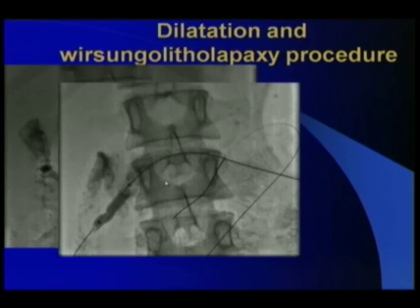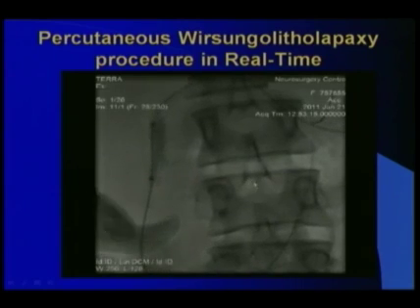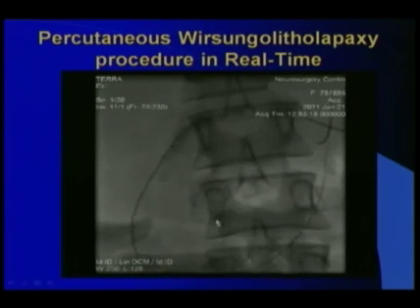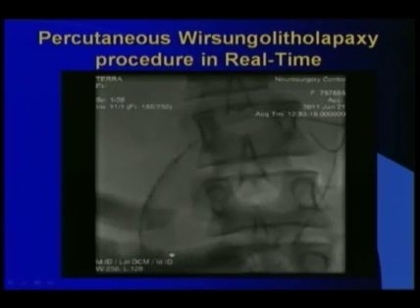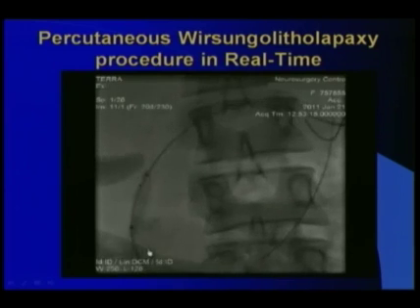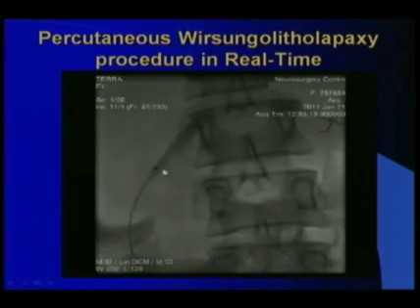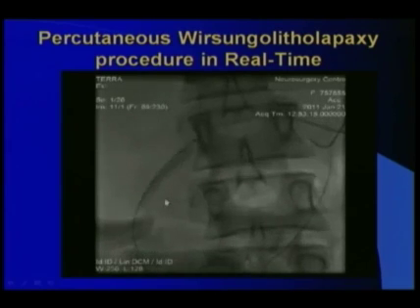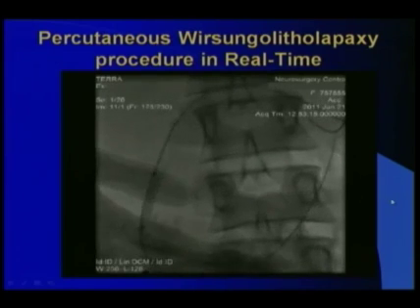You see the dilated balloon in the Wirsung duct, and this is the post-procedure image showing 2 ducts which are connected directly with the duodenum. You can see this process in real time. You can see here the half-inflated balloon, and note how we are pushing down into the duodenum those stones, which are evacuated from here approximately. I show it again. These are the stones here, and you can see how we push them down from the Wirsung duct into the duodenum.